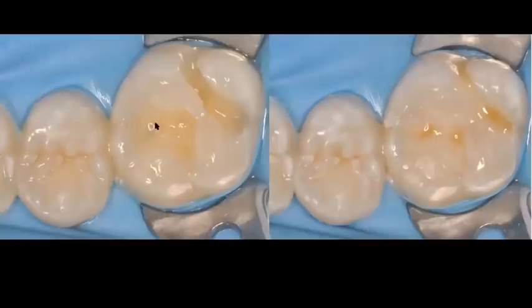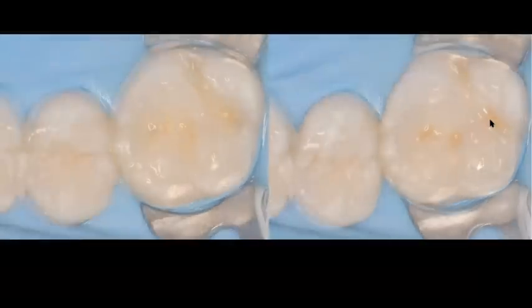In this particular case, I'm going to do 1 horizontal layer on the bottom, and then 2 or 3 oblique layers on the occlusal aspect. Same thing here on the distal lingual groove. We're going to do only oblique layers, and you can see one on this side of the tooth, the more mesial aspect of the preparation, and one on the more distal aspect of the preparation, or lingual aspect. We do 2 oblique layers so that we can recreate a little groove in this layer. So again, we're thinking about how we layer composite so that we can get the occlusal anatomy from the start without then needing to use a burr towards the end of my restoration.